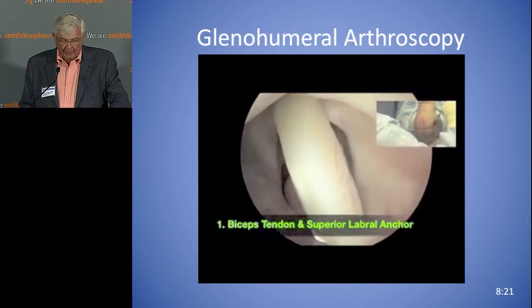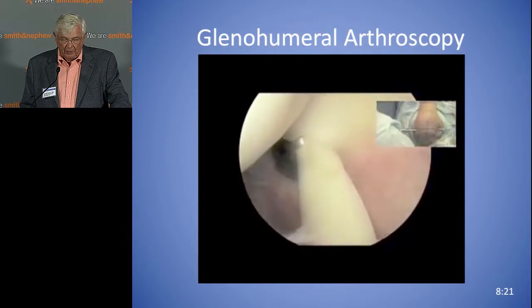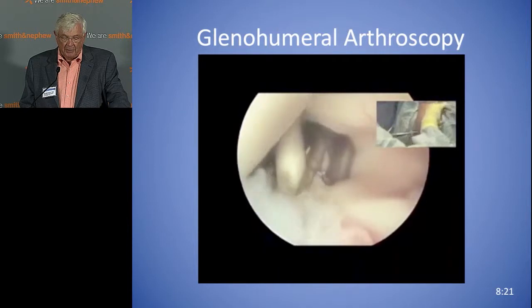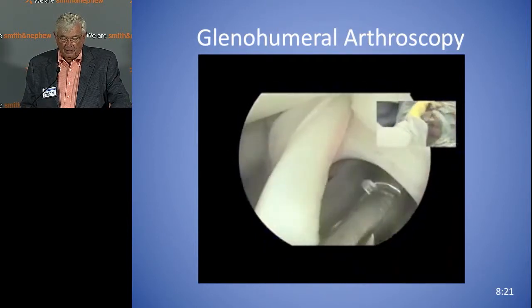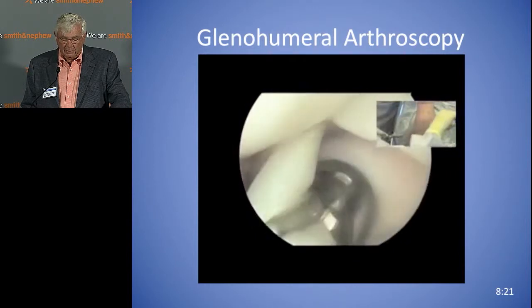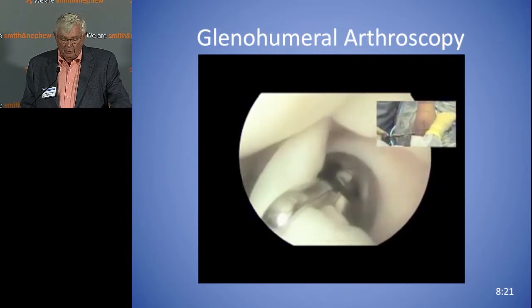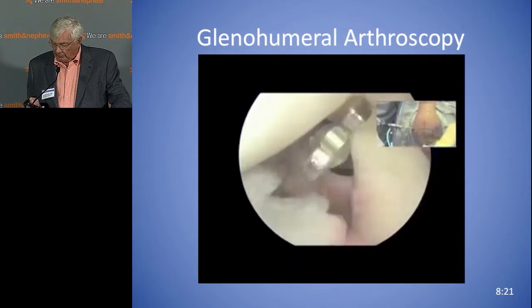Here's the biceps tendon. Just take a good look at the biceps — you can move it, push it around, pull some of it into the joint. You can see how it fits up against the subscapularis on your right. There are articles by Dr. Habermeyer on so-called pulley lesions and pathology in this area. So you should understand that area and get an idea of what the tunnel looks like in that particular part.